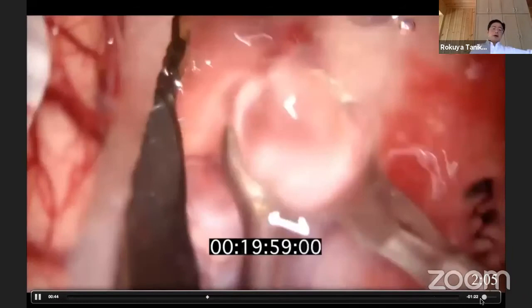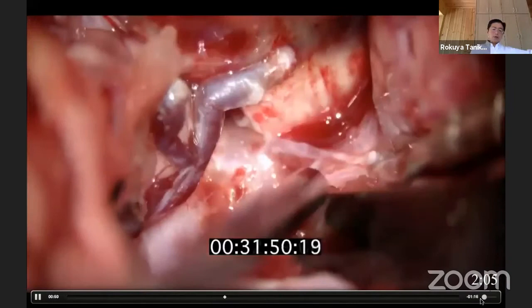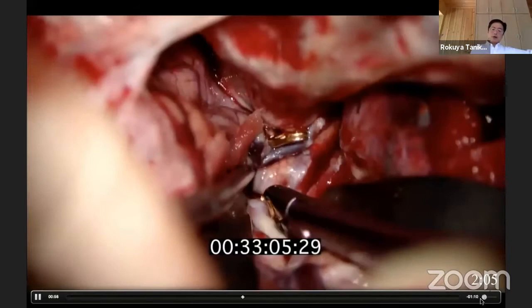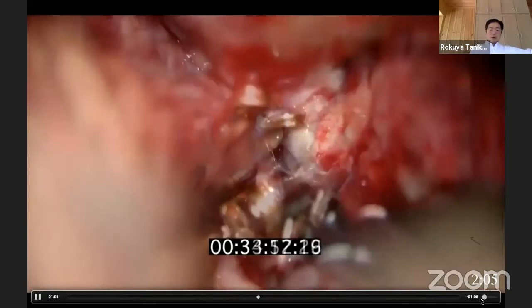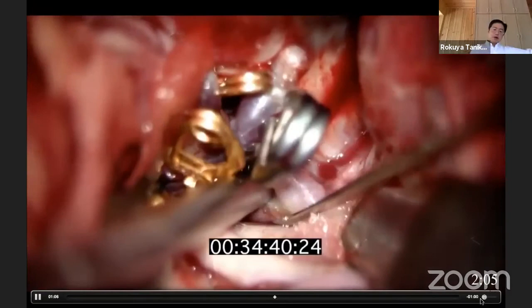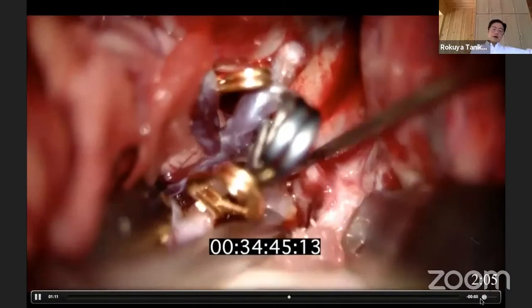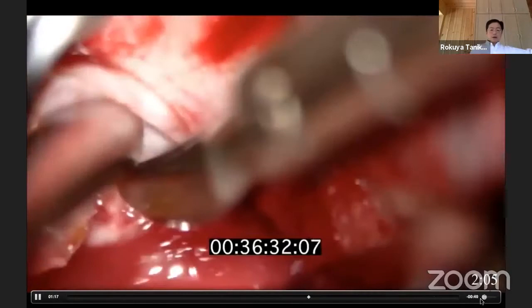This is a decompression by partial removal of the hematoma, not to injure the bleeding point of the ruptured aneurysm, because the hematoma is connected to the rupture point. Now a temporary clip is placed on the supraclinoid carotid C1 segment. Tentative trapping of the aneurysm then allows clip placement on the neck — reducing the aneurysm tension is important because without reducing tension it causes neck laceration.